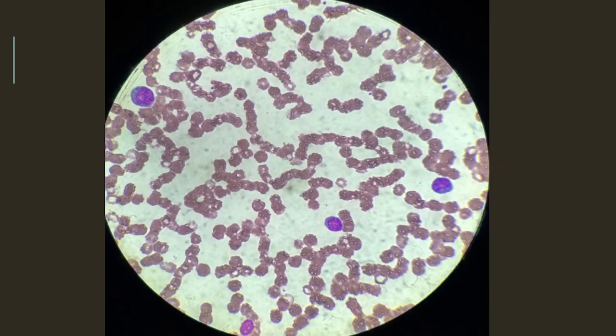Today's case is a peripheral smear from a patient with a fever. Here we can appreciate these larger lymphocytes, which are larger than the normal mature lymphocyte, and they have a deeply basophilic cytoplasm.